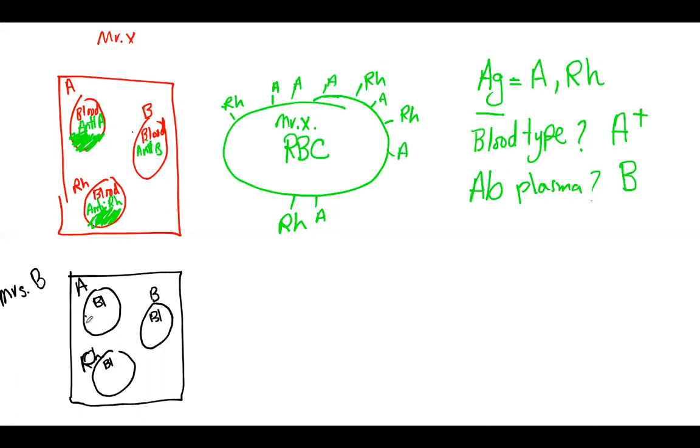And I want to make sure you guys understand this. This is a synthetic anti-A that I'm adding. It is not what you found in your body. This is a synthetic version, basically a tube that you are adding to the sample. And then anti-RH antibody. And I'm looking at this sample, and the only one that is clumping would be my B.